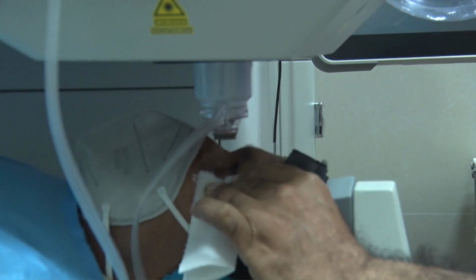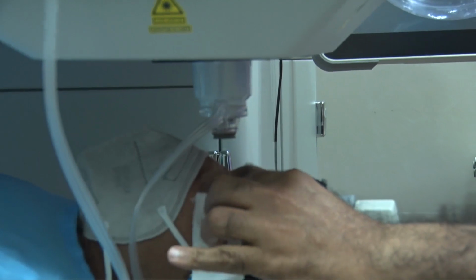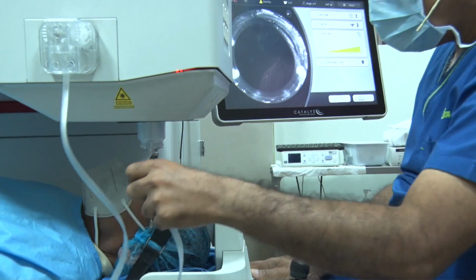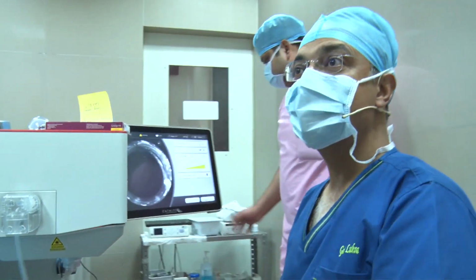So the laser is complete here. We will be moving to the other OT now for Dr. Rishi Swarup to show his case with the toric IOL on the Signature Pro. And we can move the transmission to the other OT.